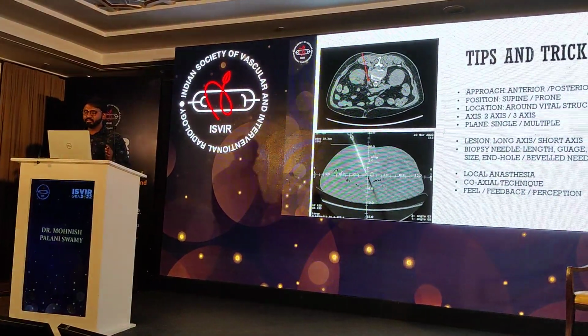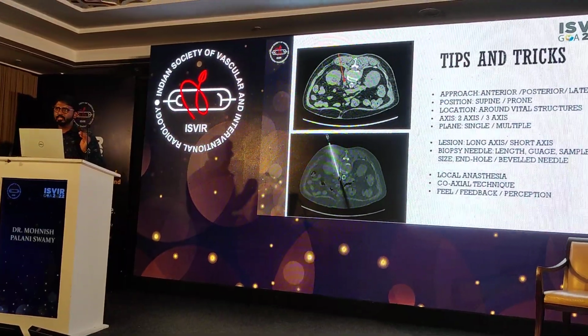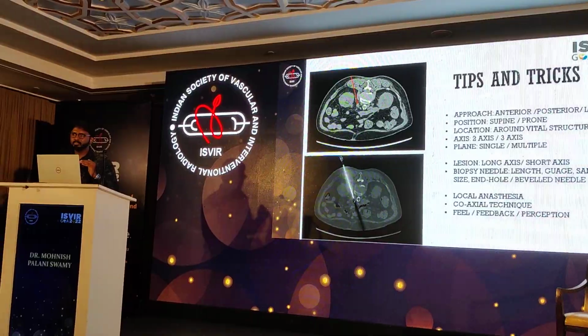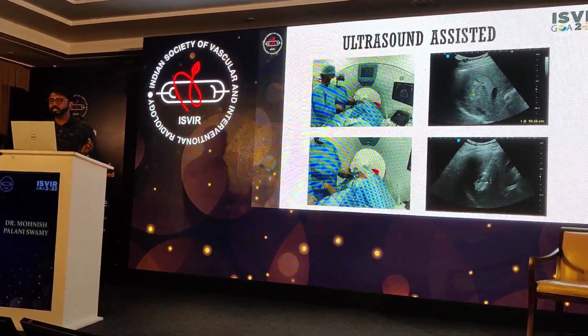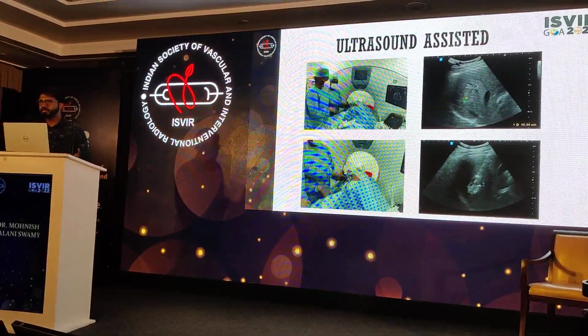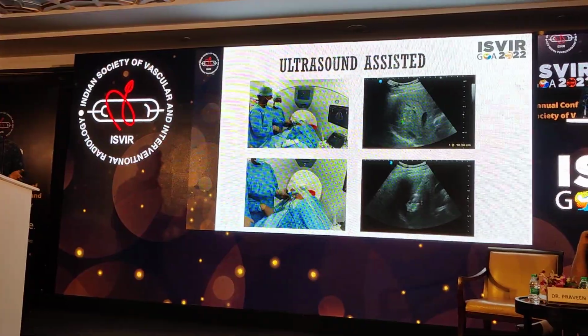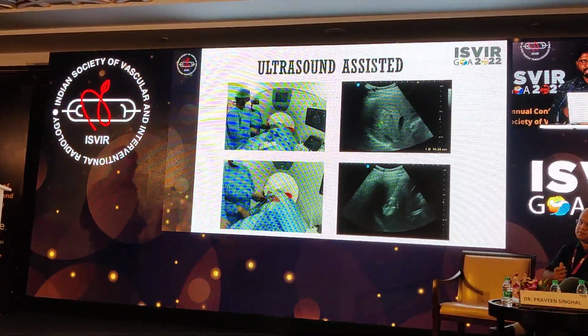So this is basically for the fellows, but this has to be incorporated all the way. Until date, I do this homework before I plan a procedure. These are the same techniques, and with a few procedures we also do ultrasound guided. It's not that once a patient is posted for a mesenteric lymph node biopsy, I just use CT.